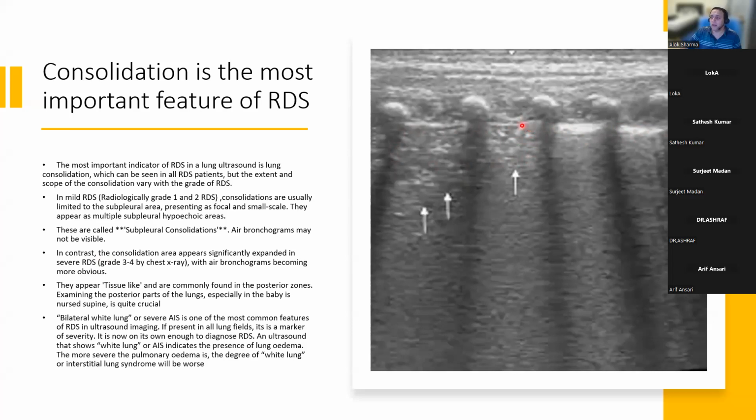And this is one of the points that's been made by colleagues who have done studies looking at lung ultrasound scores using the posterior regions, and they worry that in the early phases we might not find consolidation in the anterolateral areas, and they feel that that might be a significant fallacy.